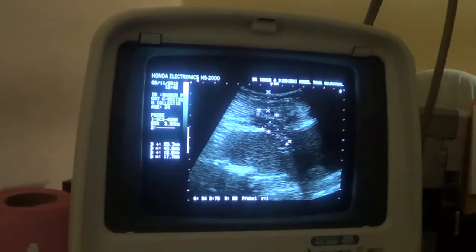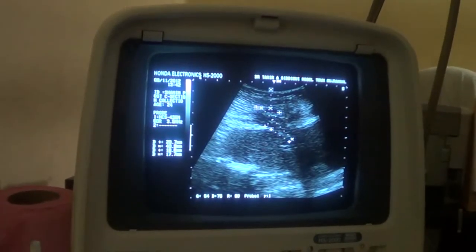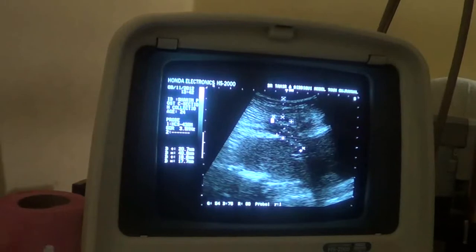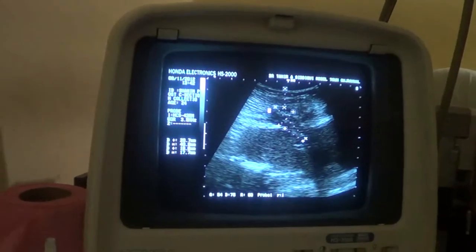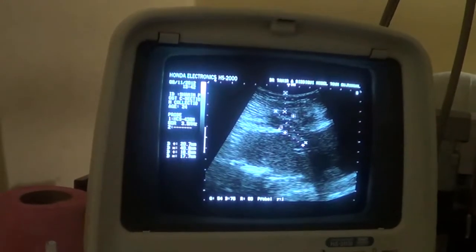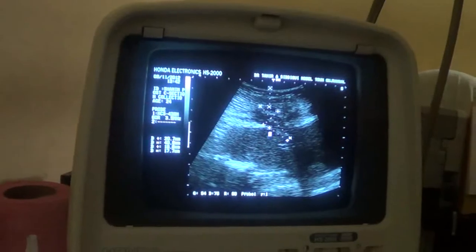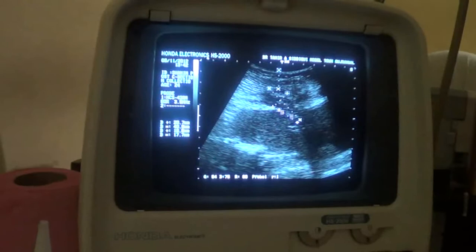It makes a track into the subcutaneous tissue, and the approximate measurement is 40 by 18 millimeters. This collection can be pus or bleed because of a breach of the mid-anterior wall of the uterus post cesarean section.